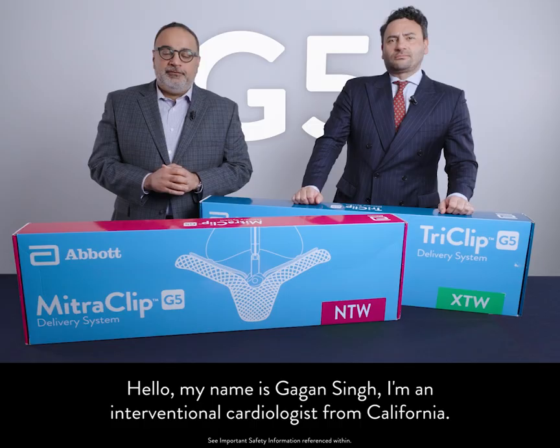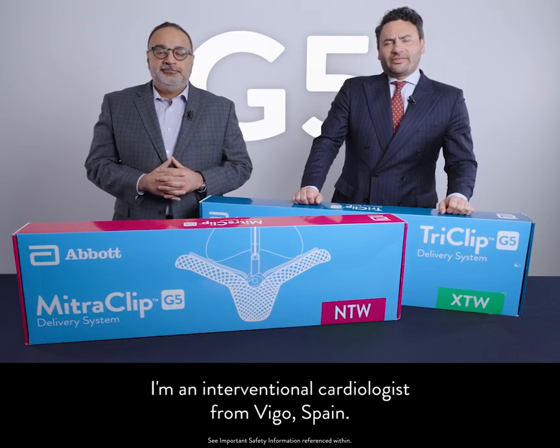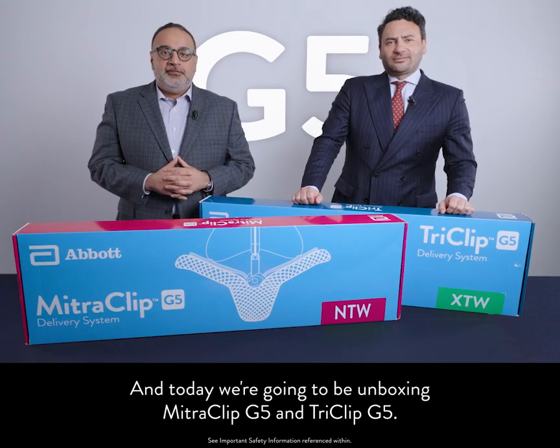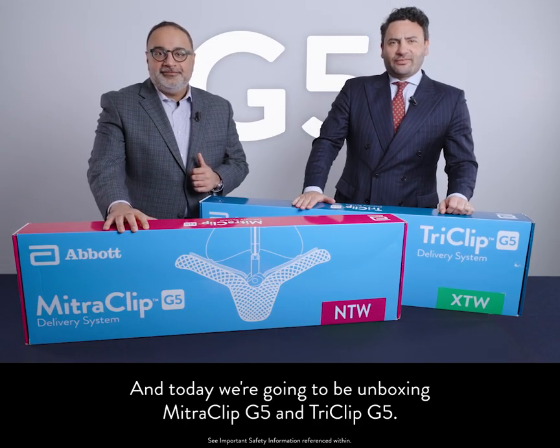Hello, my name is Gagan Singh. I'm an interventional cardiologist from California. And my name is Rodrigo Estevez Laureiro. I'm an interventional cardiologist from Vigo, Spain. Today we're going to be unboxing MitraClip G5 and TriClip G5.